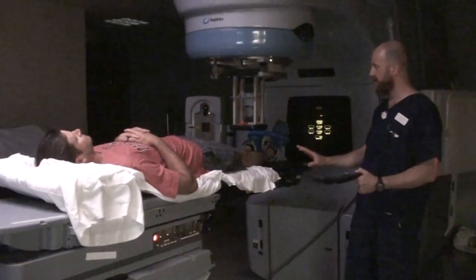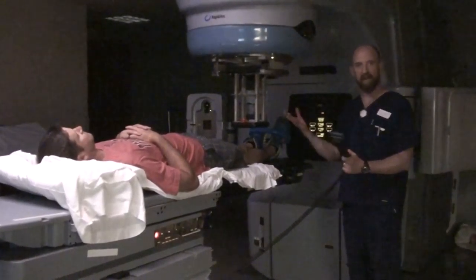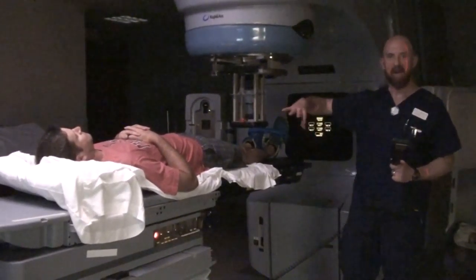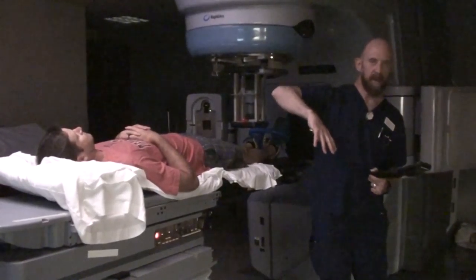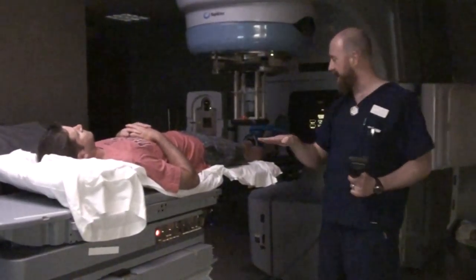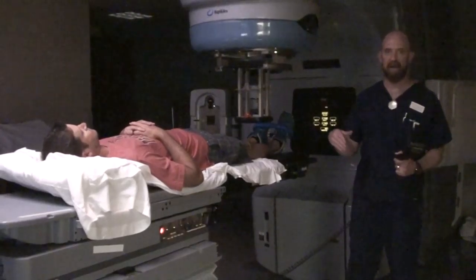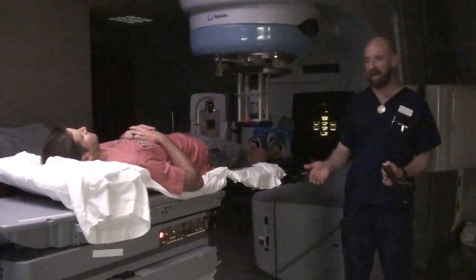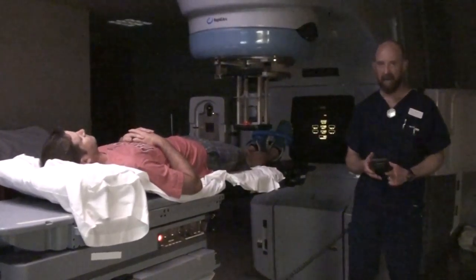You want to work so that you use a table angle, a gantry angle, a collimator angle — move the patient until you've got them flat across that surface so that you can get a nice even dose of radiation right through that area.